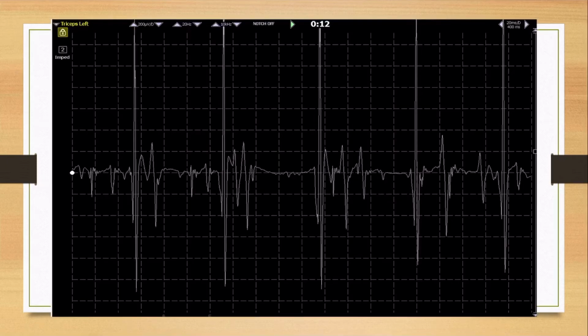and so what we've decided to do at this point is let's do some EMG. I've taken you through a little bit about the EMG on the preparatory video for this, but suffice it to say that these are large units over here. You can see some of the polyphasia going on as well.